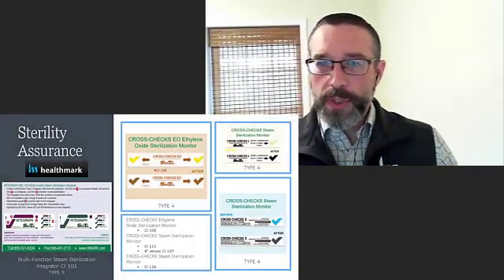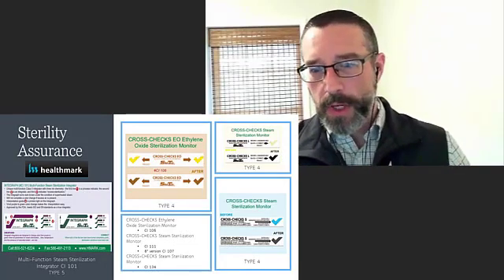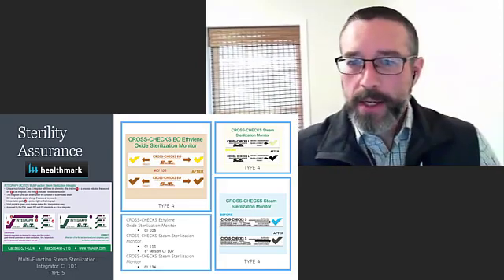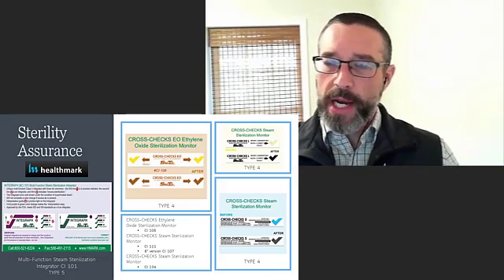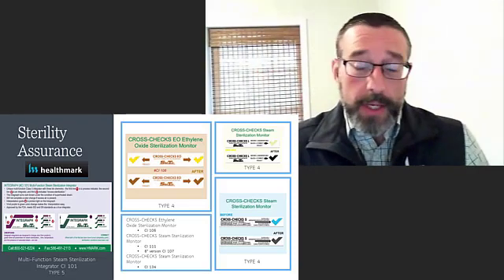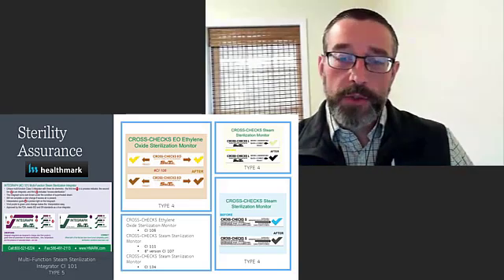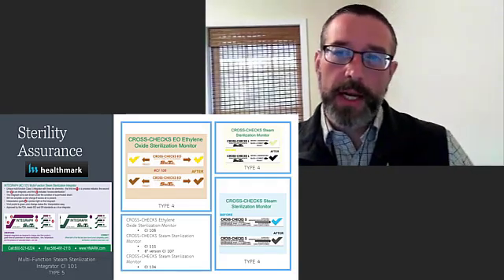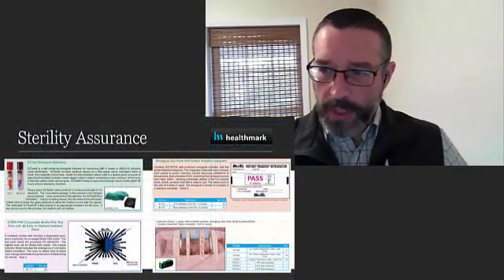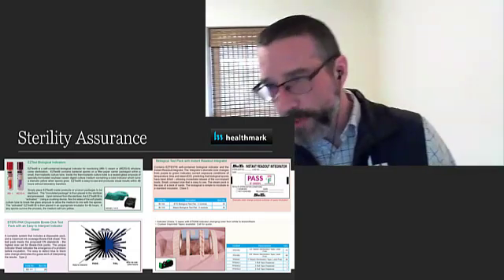And then, of course, I just have a few sterility assurance things listed here where we're talking about type 5. Hopefully everyone's come up to that if you can, because that's really the most stringent challenge that you can give to your sterilizer. A few more things for sterility assurance, as I spoke of. If you're pre-vacuum, if you're not testing your vacuum, then you don't know that you're getting the most that you're supposed to get out of your pre-vacuum sterilizer. Biological testing, and then, of course, marking tapes and things like that show cycles have happened.